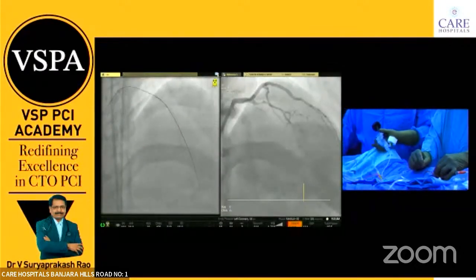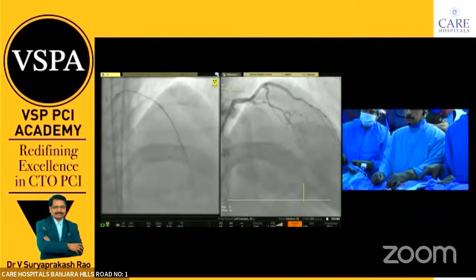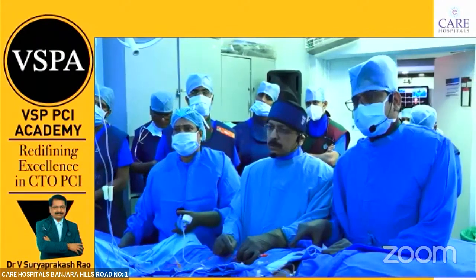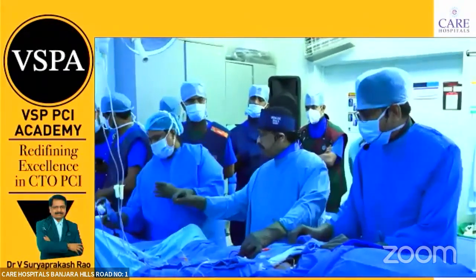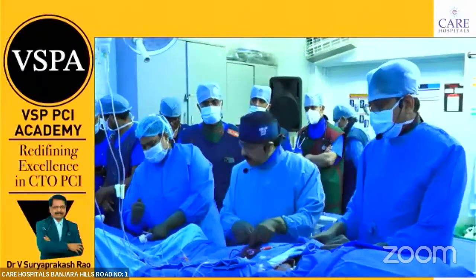Regarding this Alveo HP balloon, it is one of the low profile balloons. It has a good crossing profile. The tip of the Alveo HP balloon will be like our workhorse wire of 0.016. Our routine tip wire is 0.014. Now I will do an IVUS on this because I'm not going to give injections.